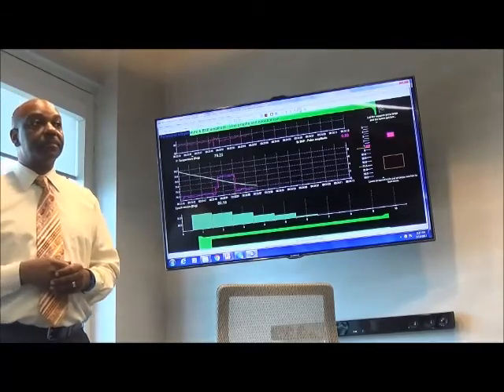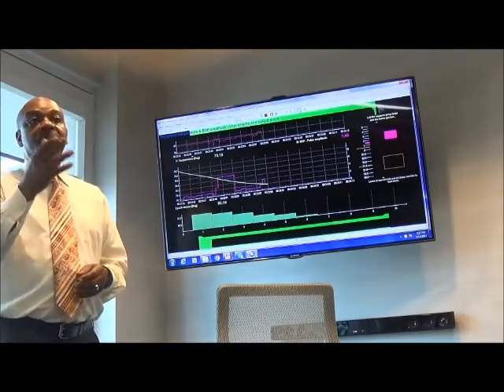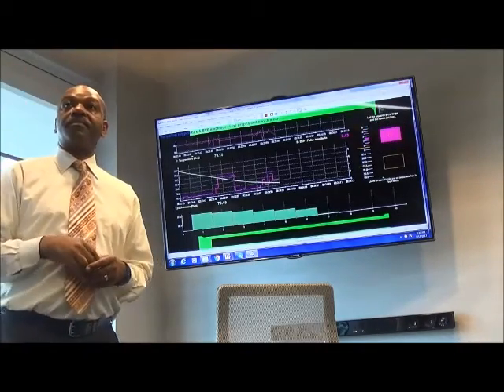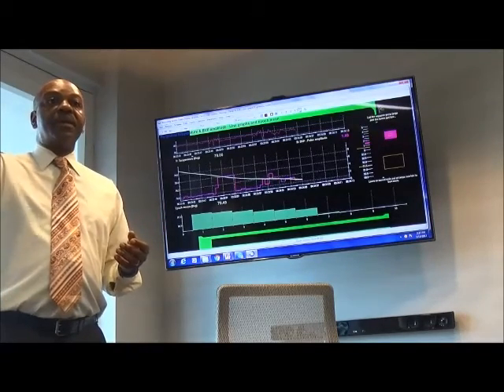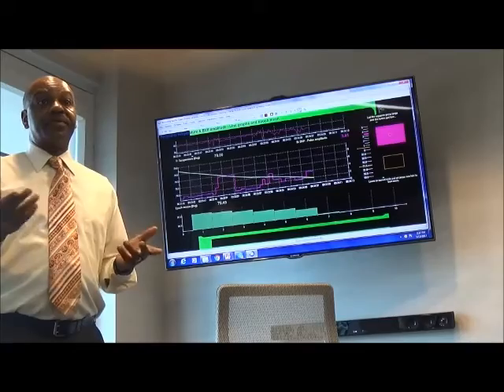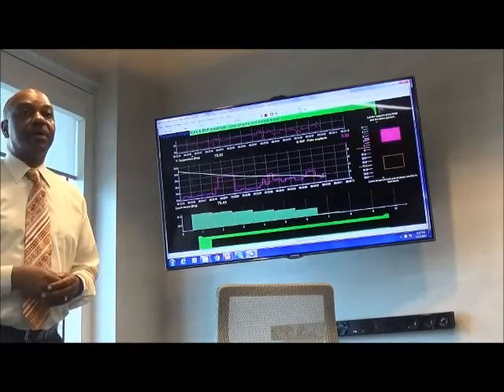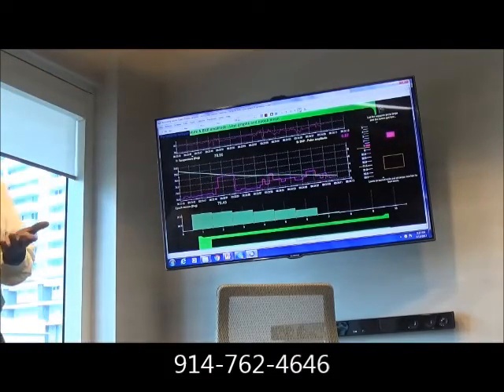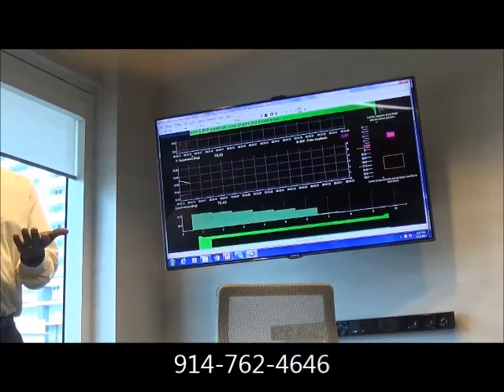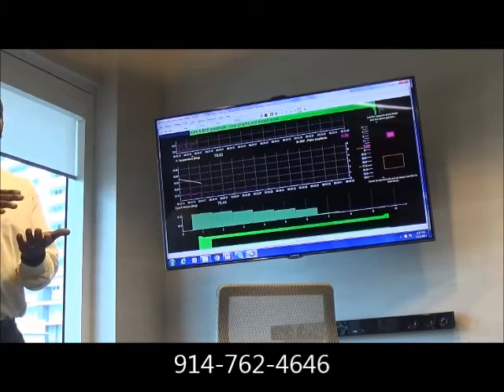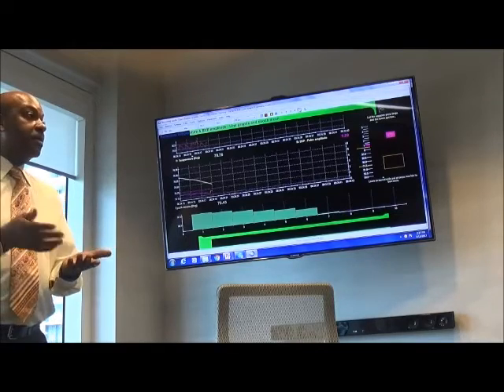You want a harder temperature? No, I just, I think I'm right under the vent. Well, the vent is here. Well, you're feeling the air though. I just feel it. It's not cold. If you have the air blowing on you, that's going to be an artifact too. So, you know, you could have the temperature, let's say your hand temperature is 84 and all of a sudden the air temperature, the air conditioning turns on and you feel the air, that's going to cause an artifact.